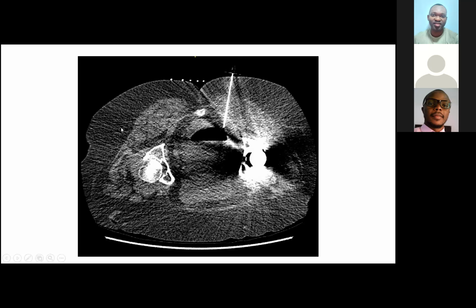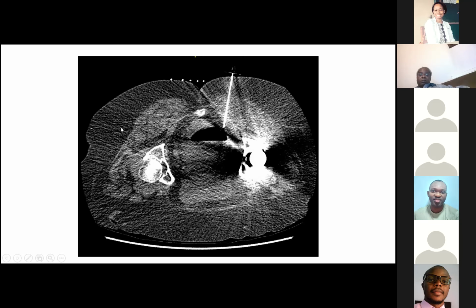And this is what my colleague did in radiology. This is just a CT scan showing one of my colleagues draining this collection via the gluteal muscles at the back, and we managed to insert a drain into this collection and drain that, and avoid the need for, certainly at least for now, surgical intervention. And so that was an example of the role of radiology linking with surgeons and clinical colleagues in terms of getting a diagnosis and also managing the patient as well.